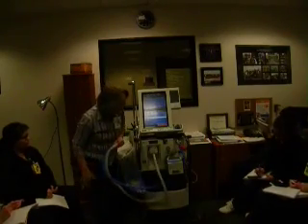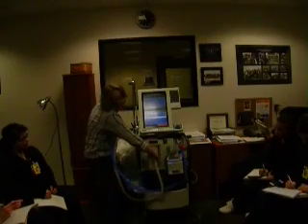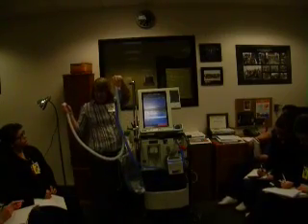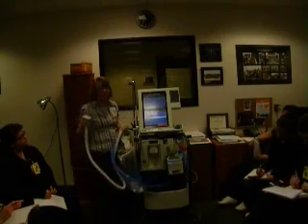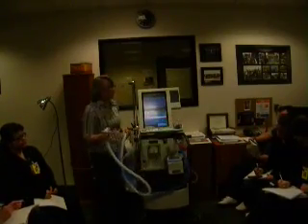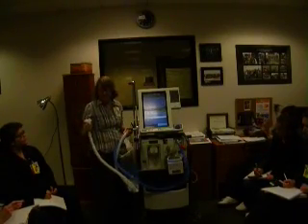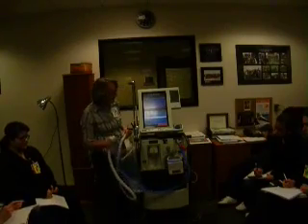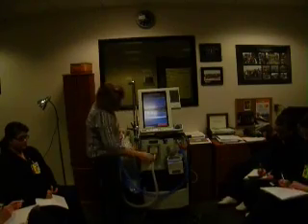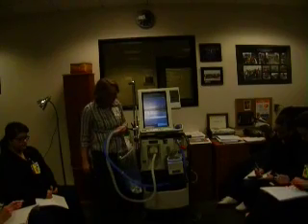So now it says disconnect from patient. From patient means the port coming from the patient, so the exhalation side. Please note my hand is still covering because it hasn't told me to unblock. So you'll disconnect from patient and then hit accept. You need like 10 hands. And then it's going to say connect to from patient, so now we're going to put it back on, because it wants the side that was coming from the patient. And then hit accept again, and it'll keep going.